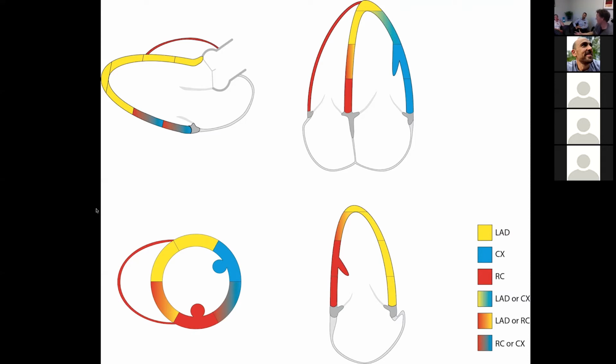I'm particularly thinking of my cardiologist friend. I think every intensivist who's learning advanced echo needs a cardiology friend to give them pearls and pitfalls. And his one for me was regional wall motion abnormality, and he says it guides you, as I said. It doesn't help rule in or rule out anything because it is such a variable feast of supply. Okay. So when you see it, you just describe the segments that are involved, rather than make a conclusion about which?